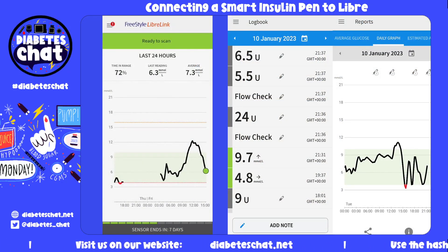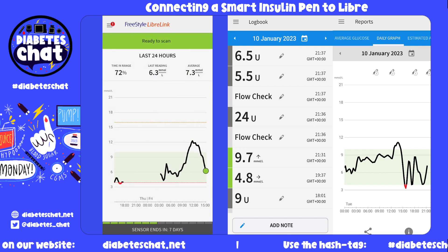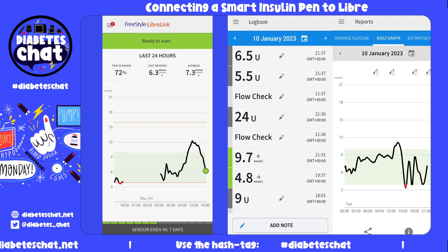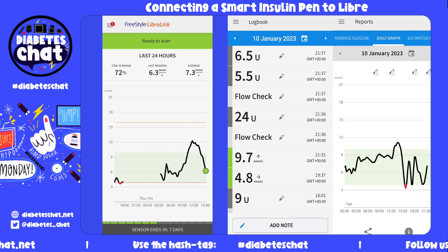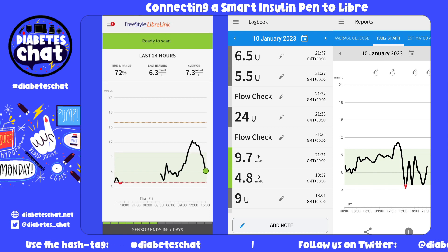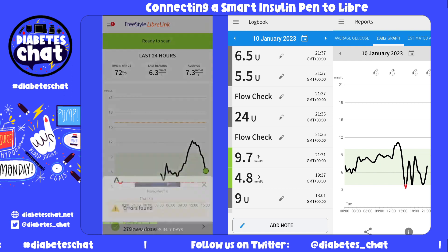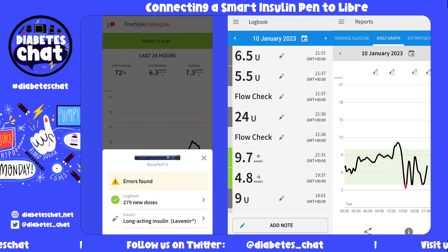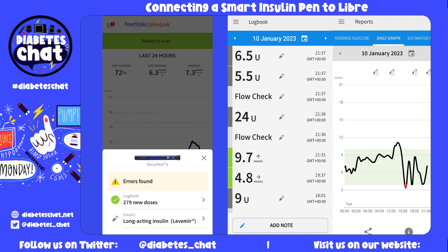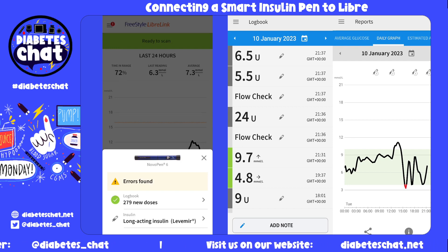Let's have a look now — put in my data onto the FreeStyle LibreLink. Again, make sure your NFC is enabled. Click down the memory mode on your chosen device. It is scanning the pen, and there you will see some information about your pen. So 279 new doses have been logged, and they are long-acting.